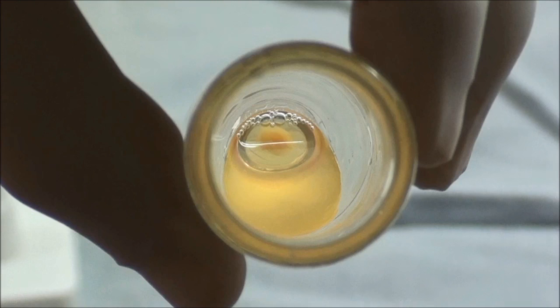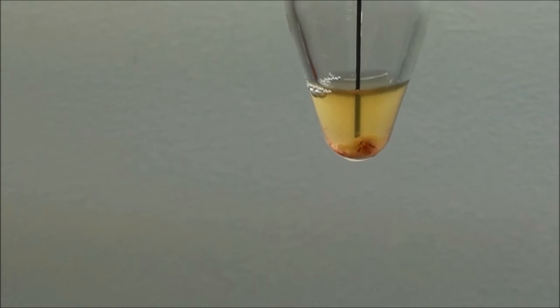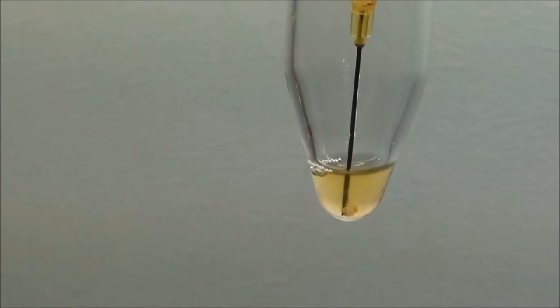Mix the platelet concentrate in 2.5 to 3 cc of plasma so at the end you have around 3 cc of PRP solution. Fill it in an insulin syringe.